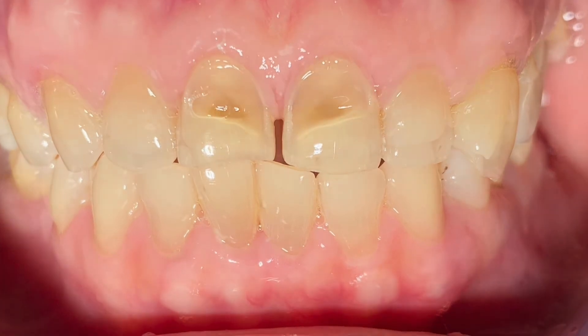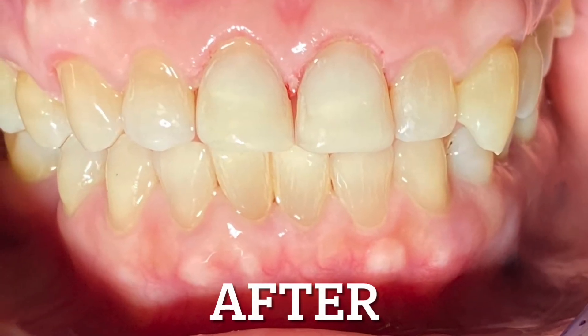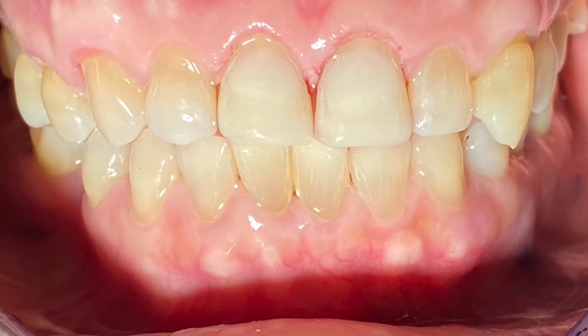As you can see, originally there was a very significant grinding problem there. But now no more — it's a Class I occlusion.